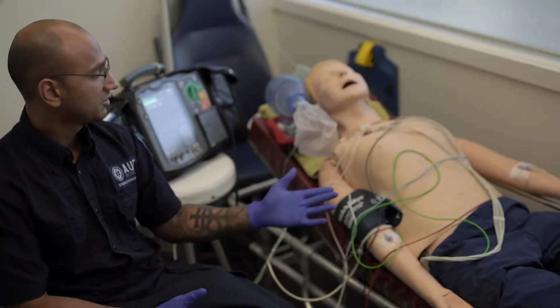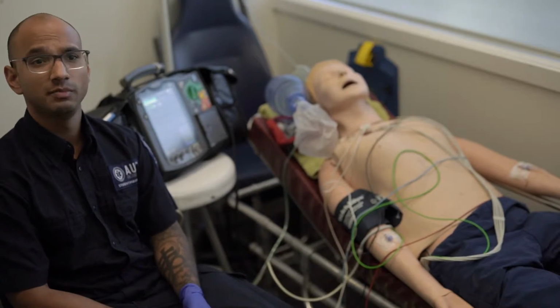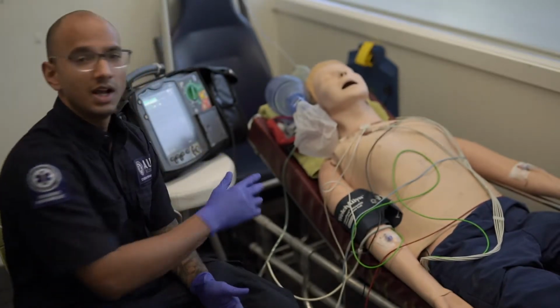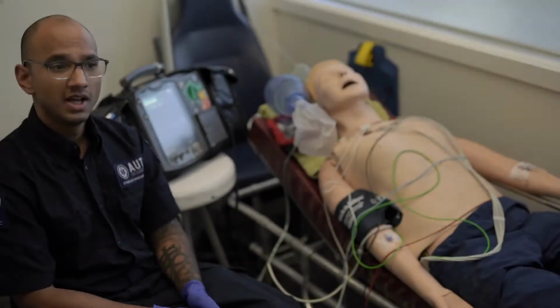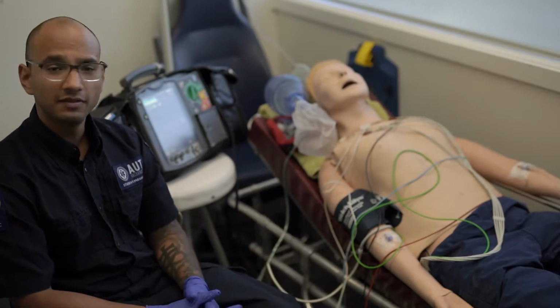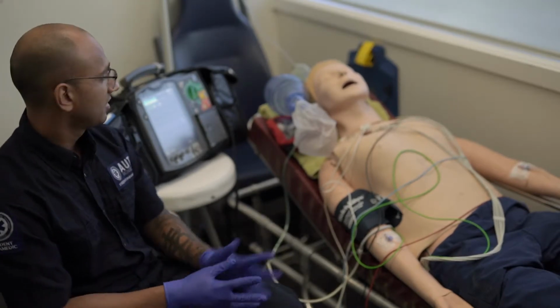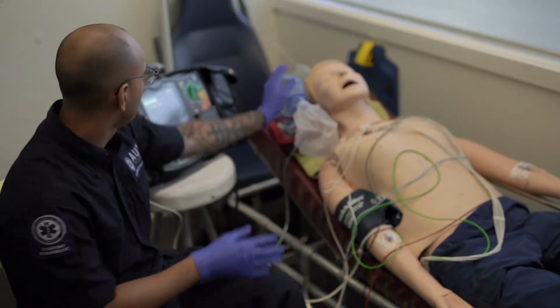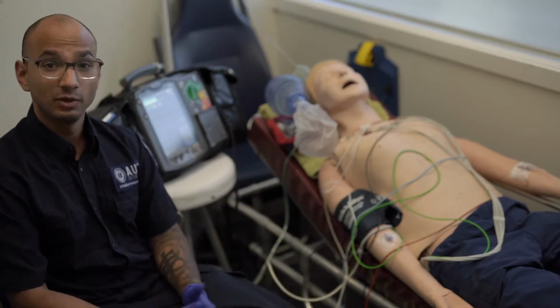Now, differential diagnoses for what could be causing his issue could be electrolyte imbalances, infection, or SVT with aberrancy. Now, because he qualifies for cardioversion, we must prepare for a resuscitation just in case. We've got all our airway gear ready, we've got bilateral IV lines and some fluids running.